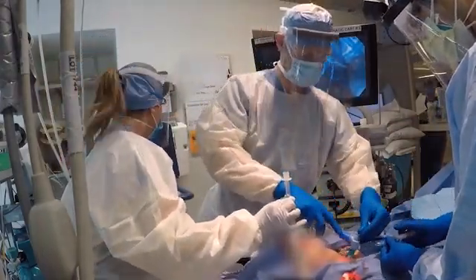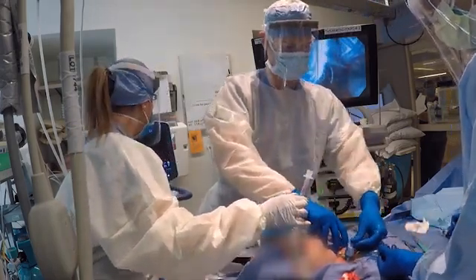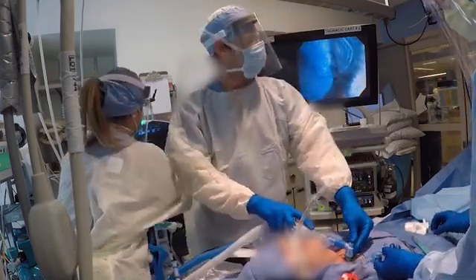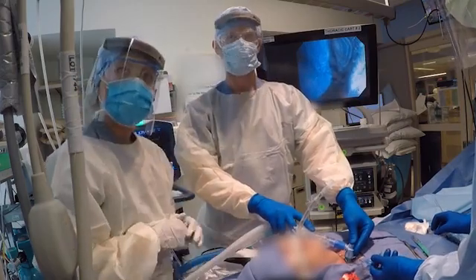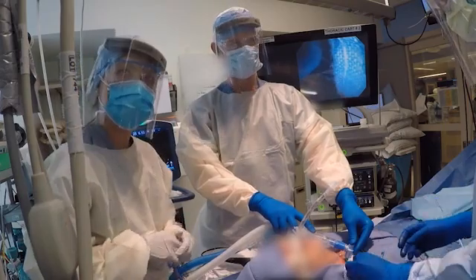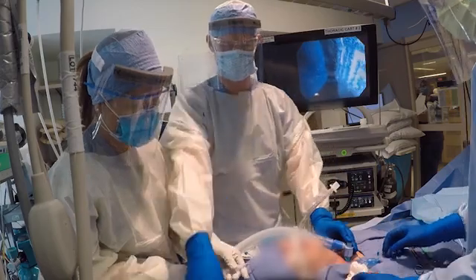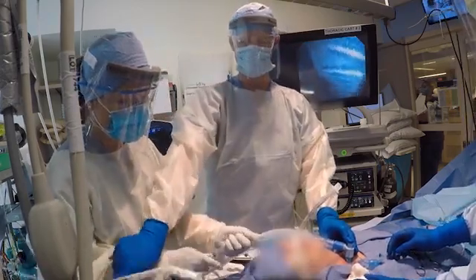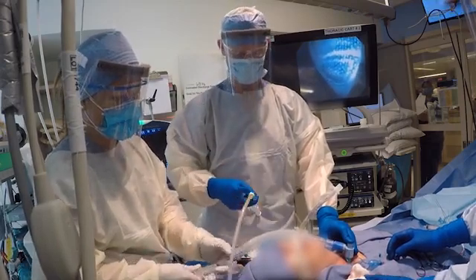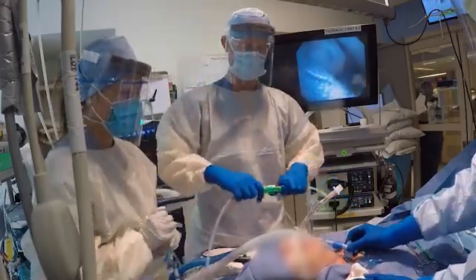Inflate the tracheostomy cuff, connect the circuit to the tracheostomy tube, and resume ventilation. The presence of end-tidal carbon dioxide confirms placement in the airway. Alternatively, the bronchoscope can be reinserted through the tracheostomy tube to visually confirm placement within the airway. Once satisfactory placement is confirmed, secure the tracheostomy tube with a tracheostomy collar. If a purse string suture was placed, tie down the suture to close the skin incision around the tracheostomy. Once the patient is appropriately ventilated through the secured tracheostomy tube, the oral endotracheal tube may be removed.